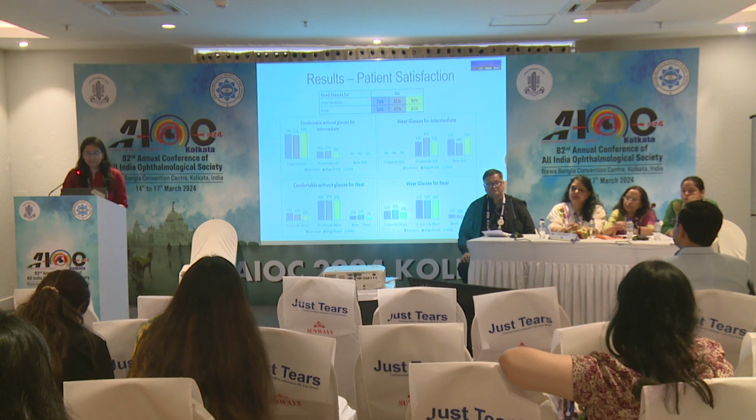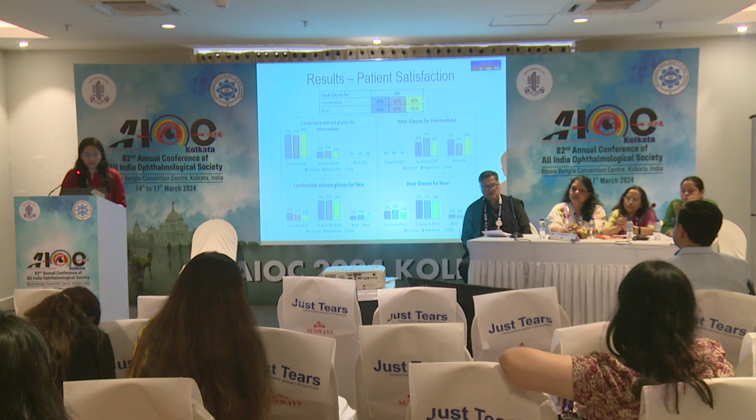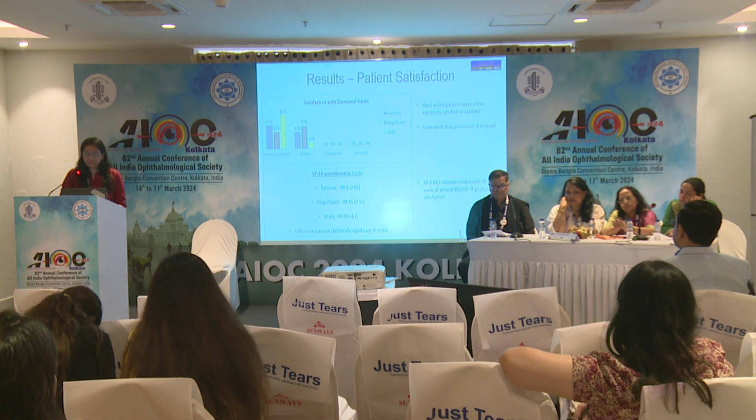Coming to patient satisfaction, most of the patients in all 3 groups said that they did not need glasses for intermediate vision, and majority, that is around 80% of the patients, were comfortable without glasses and never or only occasionally had to wear glasses for intermediate vision. Most of the patients were either extremely satisfied or satisfied, and none of them were disappointed or distressed in either of the lenses. And according to Visual Function Questionnaire 14, it gave good patient satisfaction with a score of 99 out of 100.